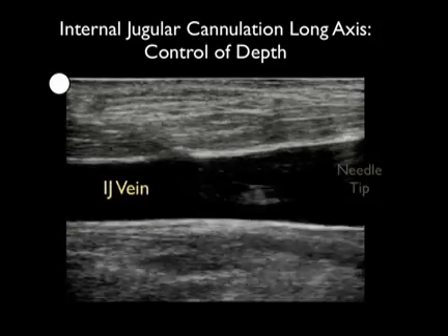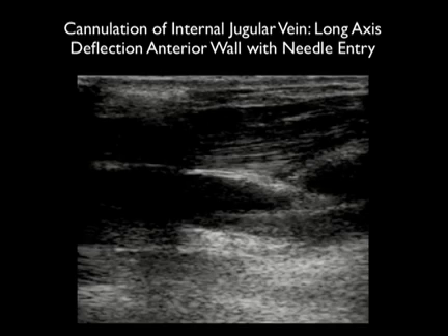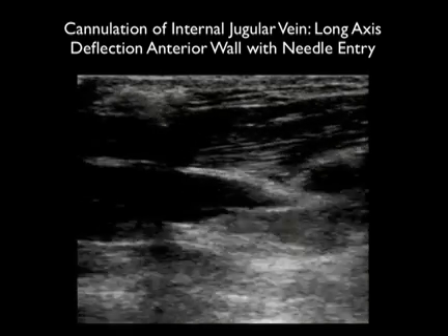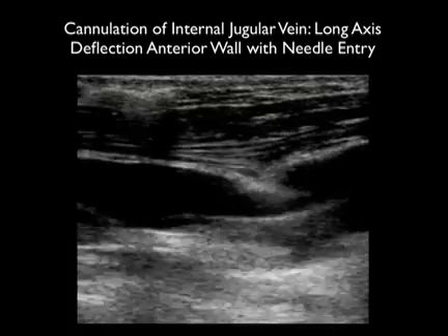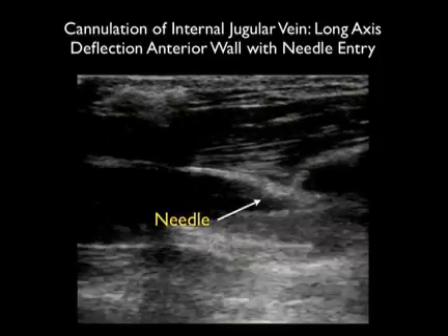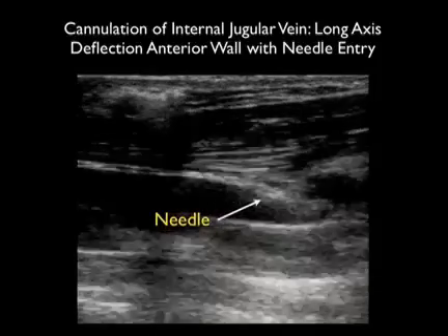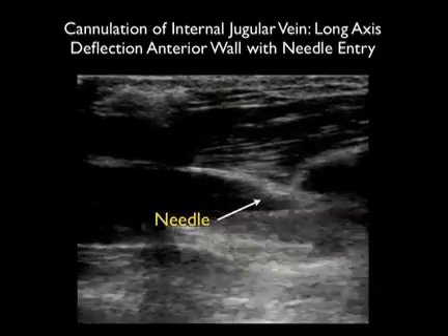Here's a video clip in the long axis configuration emphasizing that the long axis view is great for determining needle depth. We see a needle coming in from left to right and we can visualize the needle tip squarely within the vessel lumen. Here's another long axis clip of a patient receiving a central venous catheter. Notice here the needle tip deflects the anterior wall of the vessel, pushing it down so that it almost meets the posterior wall — thus the needle could easily pass through both walls of the vessel.